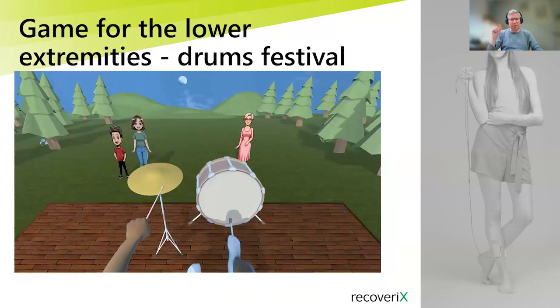This is our game for the lower extremities. We call it Drums Festival. You see here, different setting. We are out in nature, maybe a music festival in the middle of Austria with the mountains in the background.